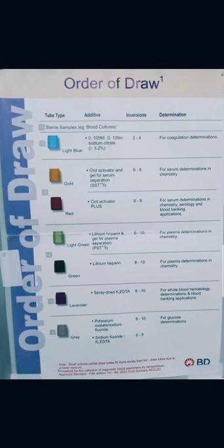Lavender: spray dried K2EDTA, 8 to 10 times inversion for whole blood hematology determination and blood banking application. Gray: potassium oxalate and sodium fluoride, 8 to 10 times inversion for glucose determination. Sodium fluoride, K2EDTA.